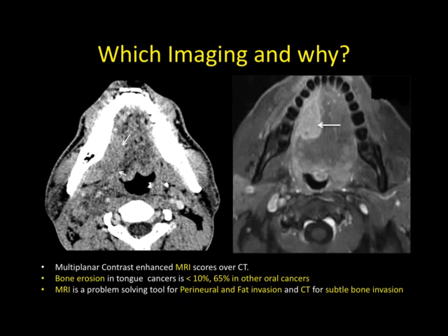And when it comes to soft tissue, you need the high resolution and better contrast, differentiating between soft tissues and the muscle per se, like the extrinsic and the intrinsic muscle. So there you need high soft tissue contrast. So what would you advocate in such scenarios where you need high soft tissue contrast, CT or MRI? MR. For base of tongue, what would you do?